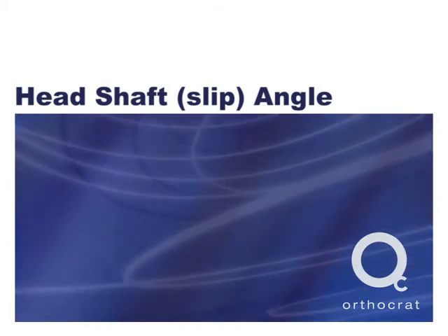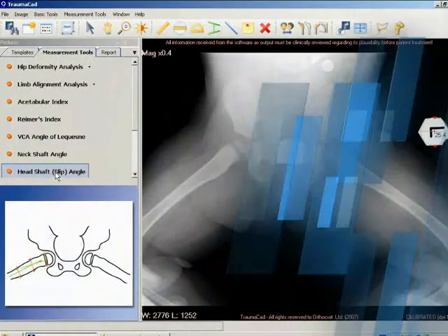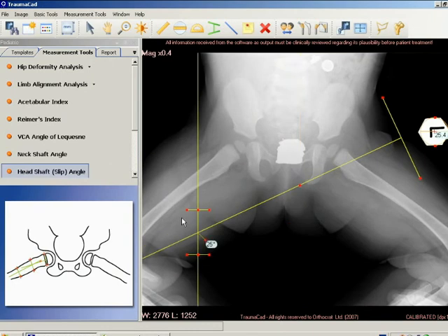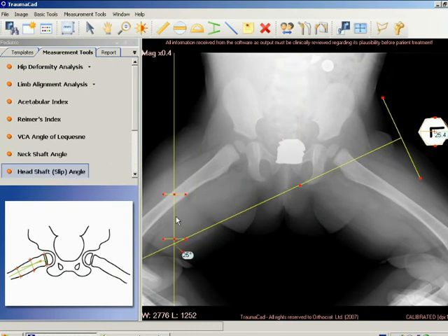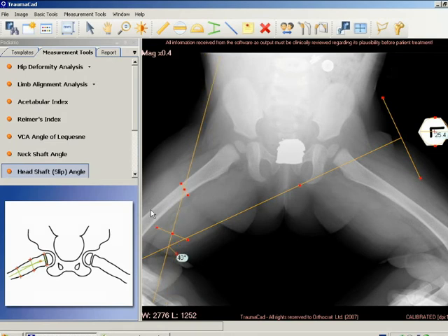The head shaft slip angle of Southwick has been used to characterize slip severity in slipped capital femoral epiphysis. The angle is measured on the frog lateral radiograph of the pelvis.